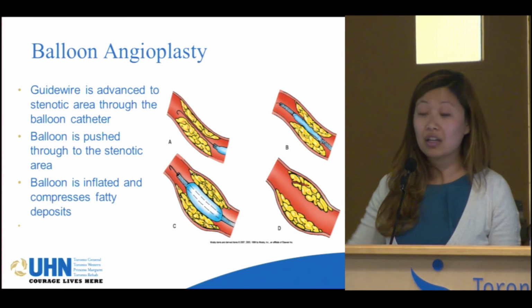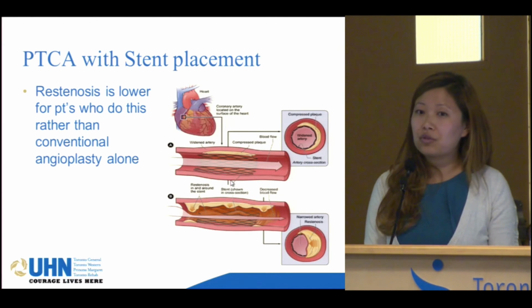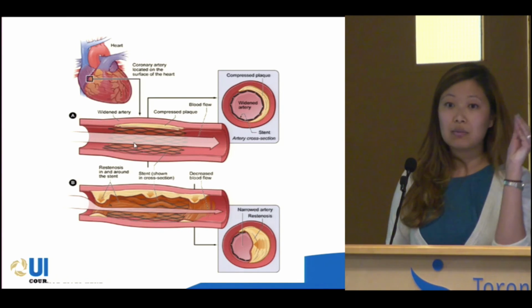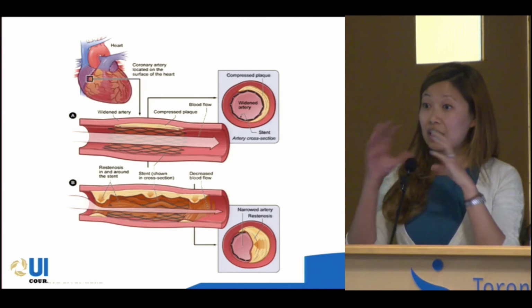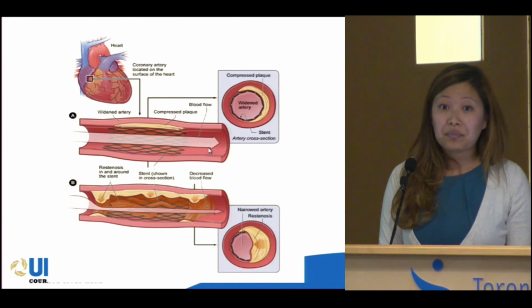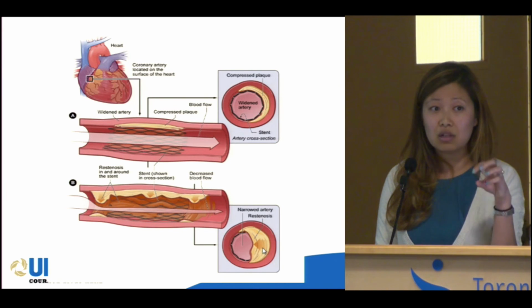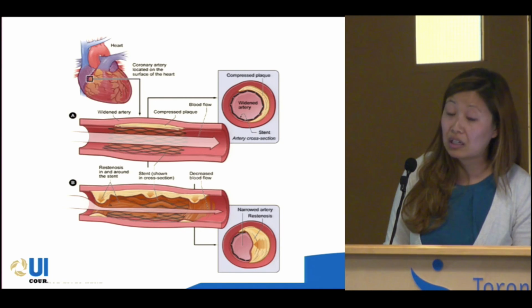And then they withdraw everything and there's flow. Okay, that's the hope. But a lot of people go for an actual stent. So it's a scaffolding, so I'll show you a bigger picture here. They put it in collapsed, and then they open it, and hopefully it sticks, it opens up your arteries, and this is what we would like to see. Unfortunately, a small percentage do get some restenosis, and so the plaque comes back. And so we might have to open it again, or we might have to go to something more invasive like bypass.